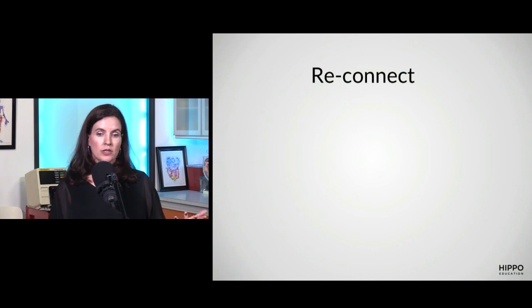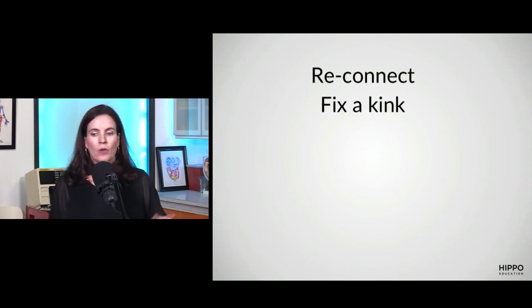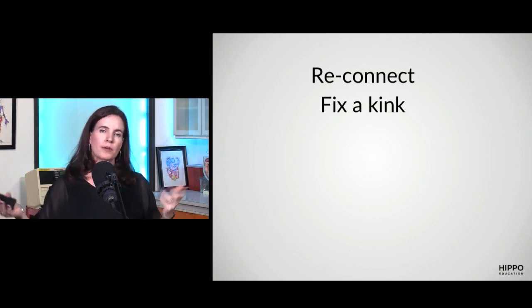So say the patient's endotracheal tube has become disconnected from the vent tubing. You could stick the two ends together and reconnect them. Easy win. I like that. Easy win, right? You could say, oh, look, the tubing is kinked in the bed rail. Somebody put the bed rail down. I'm going to lift that up and fix the kink.